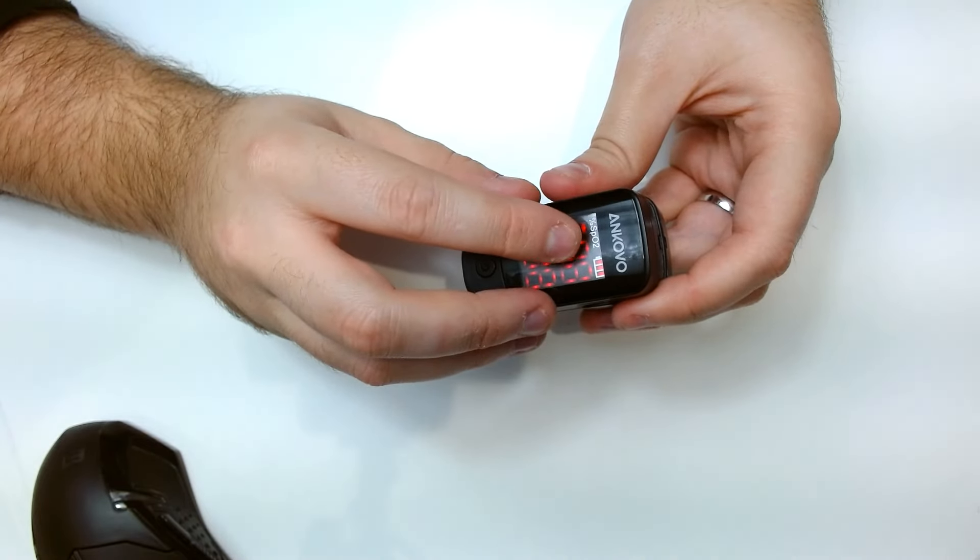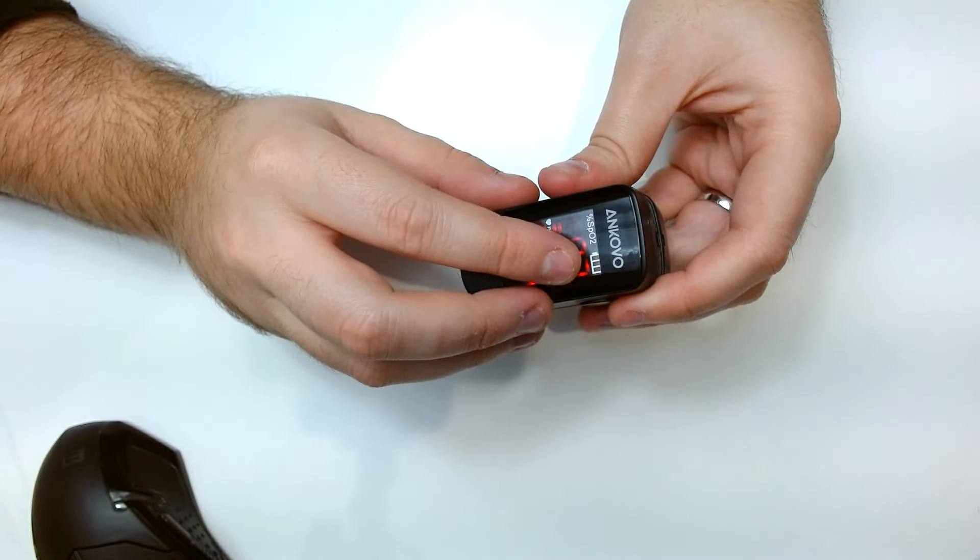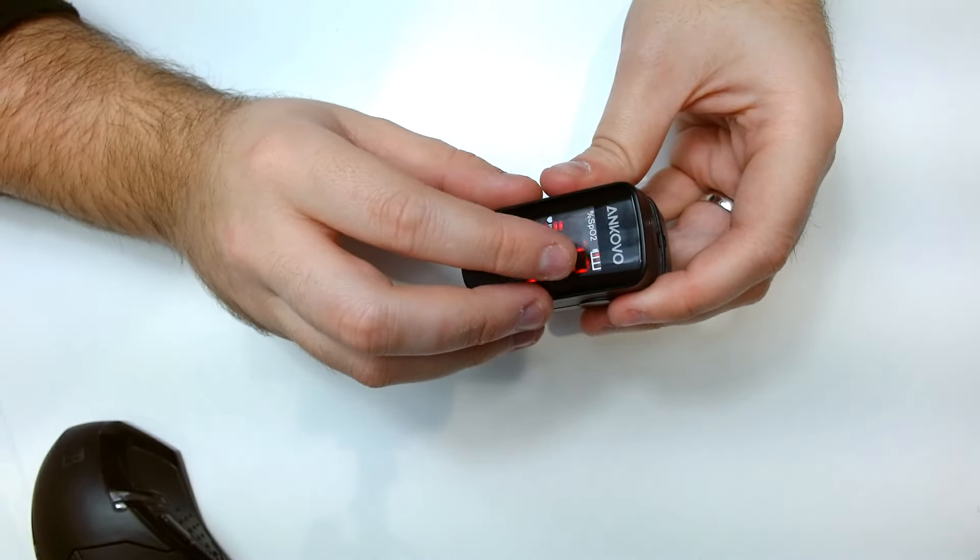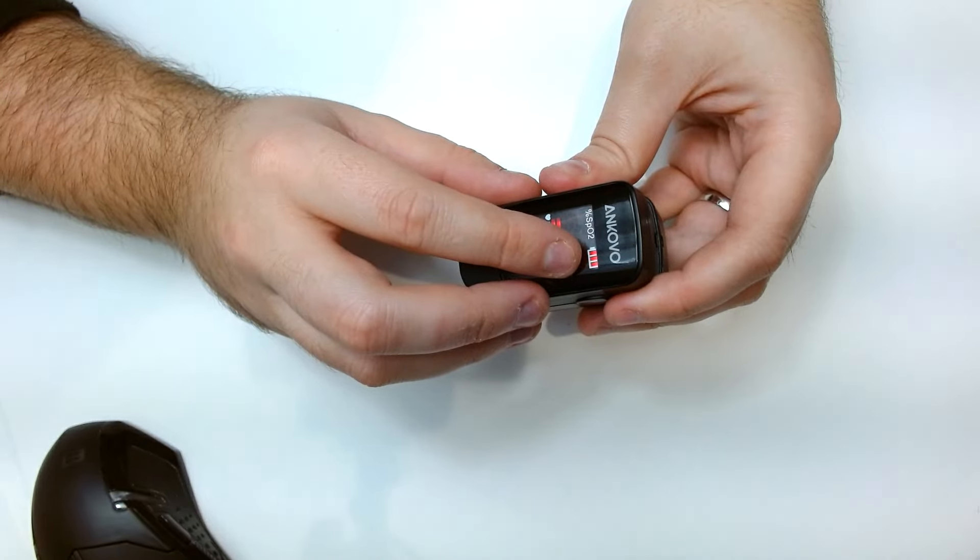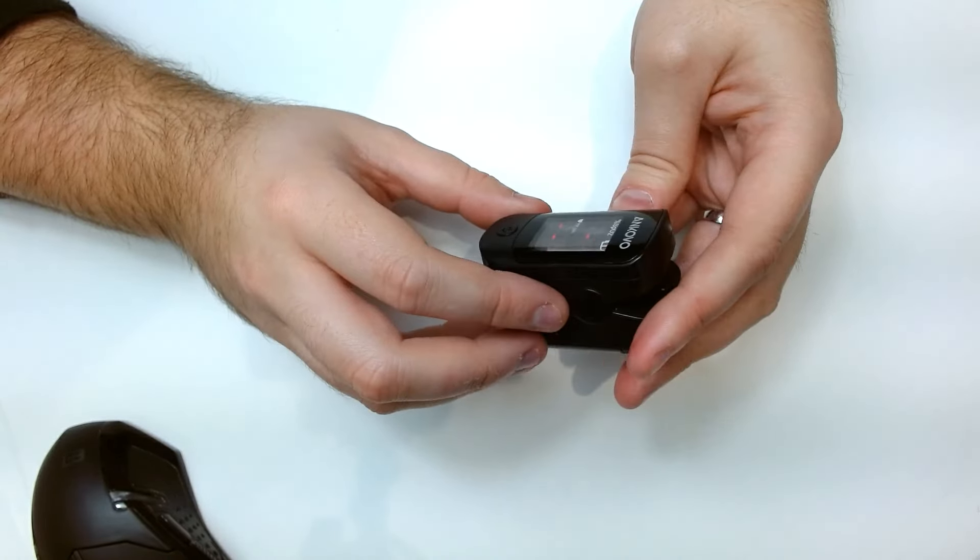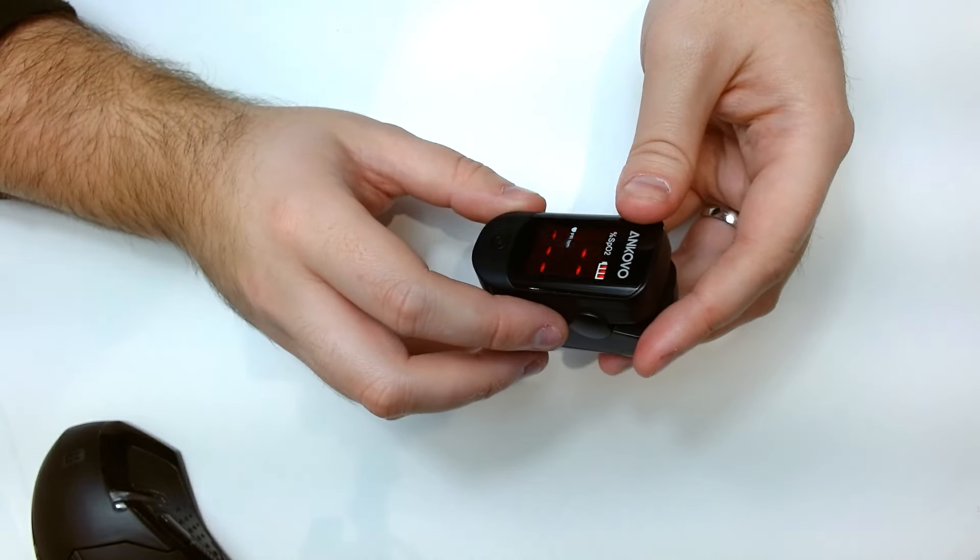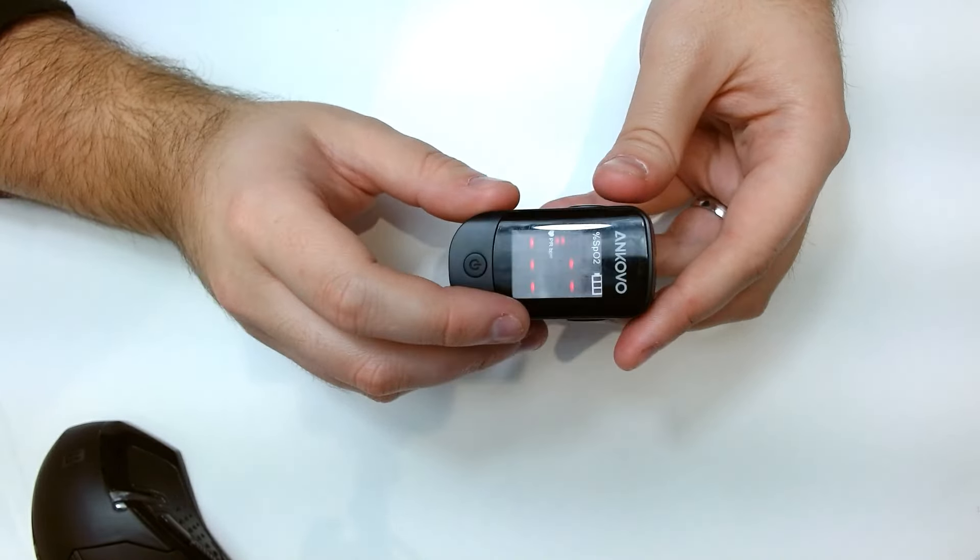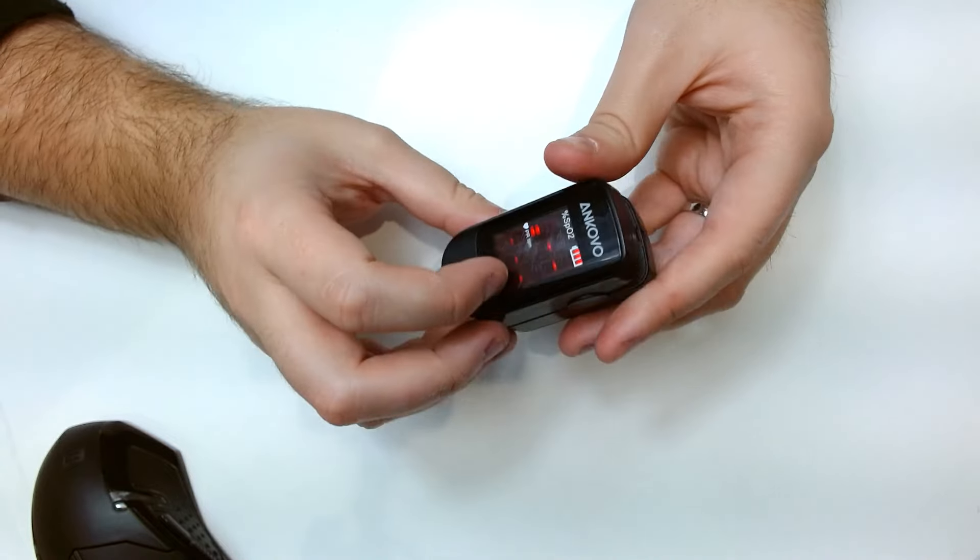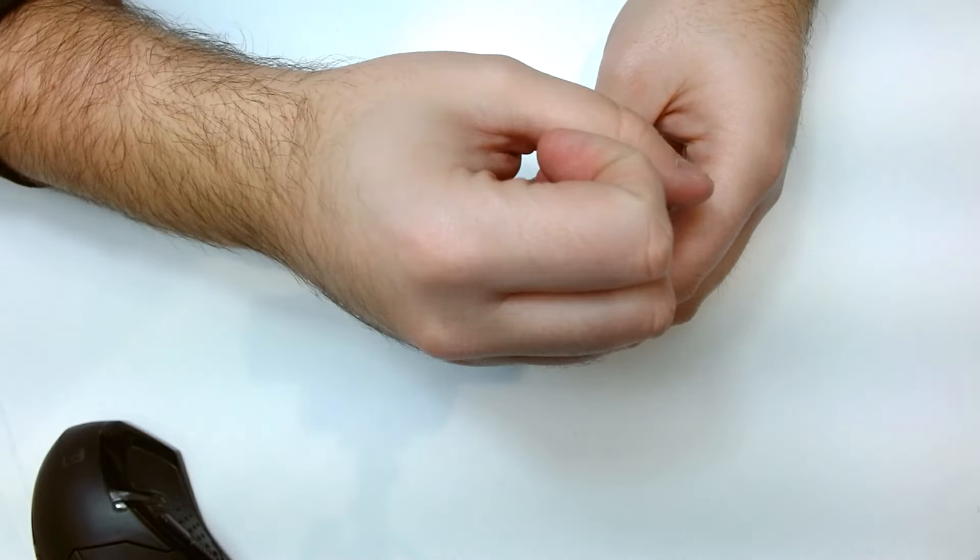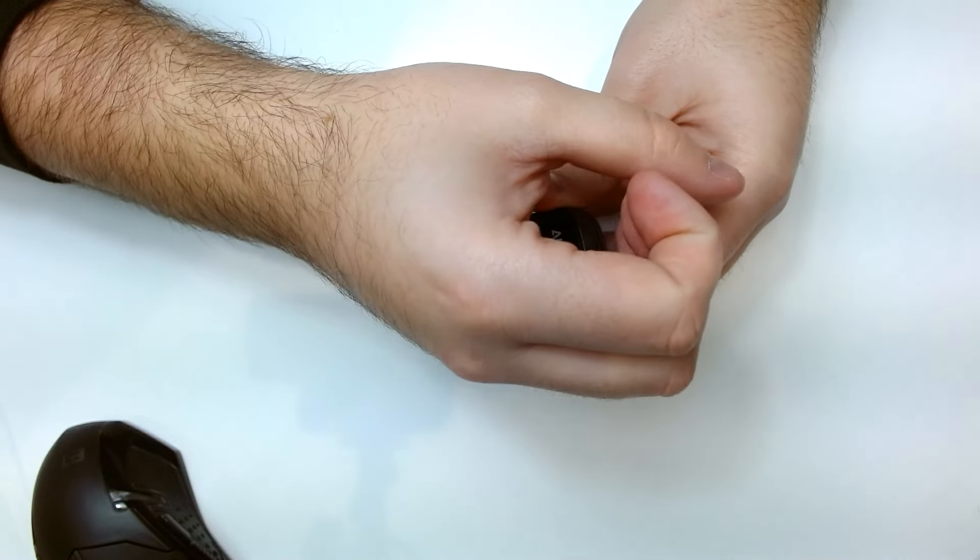It's got a little reading there which tells you the battery life. I've had this for about four months and it's not gone down on a bar yet.